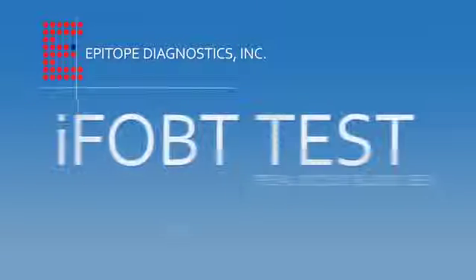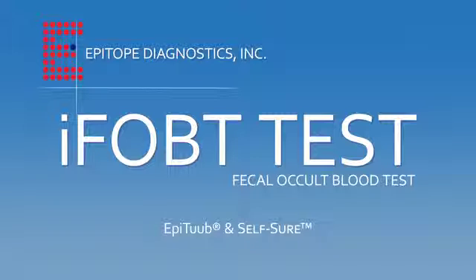The Self-Sure and Epitube FOB test was produced by Epitope Diagnostics, an innovative developer and manufacturer of rapid tests for the detection of tumors and infectious diseases. This self-contained, odorless, and patented device is used for the detection of occult blood in stools as an aid to screening for colon cancer.